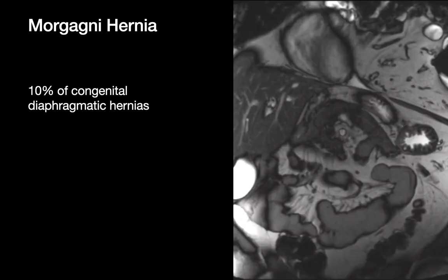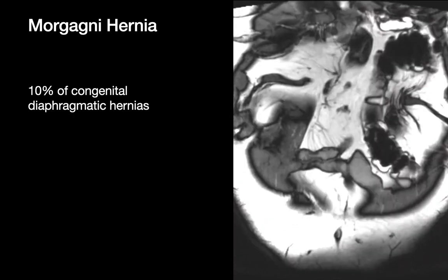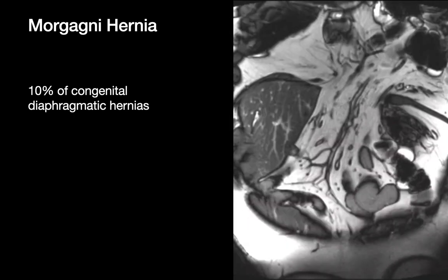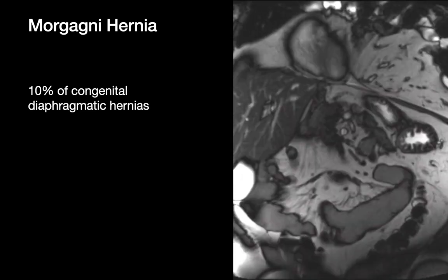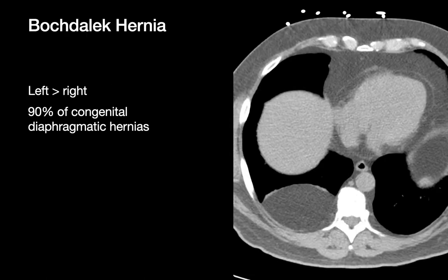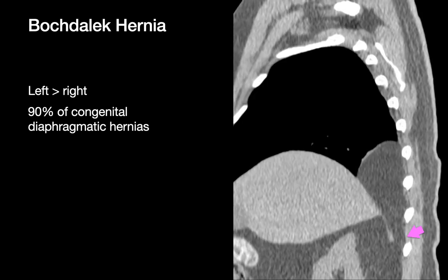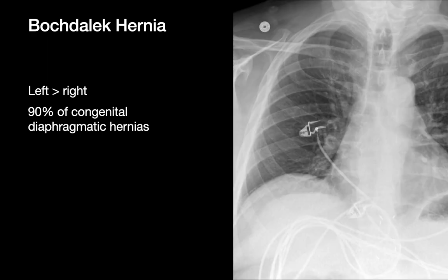Here's an example of a Morgagni hernia — mesenteric fat passes from the anterior abdomen into the anterior chest on this coronal MRI, with a segment of transverse colon and its associated mesenteric vessels. Here are a few images of a right-sided Bochdalek hernia — we can see how the posterior diaphragm doesn't reach the muscular body wall on the sagittal MPR image. These are the corresponding chest x-ray images of this particular Bochdalek hernia.